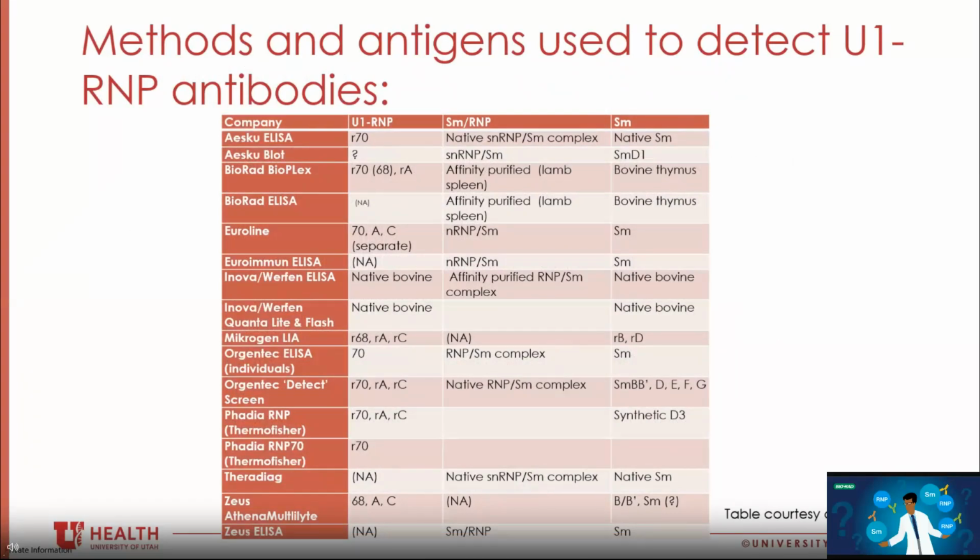Currently, the RNP autoantigen associated with mixed connective tissue disease is variably described as RNP or U1-RNP, based on the U1 RNA found to be the RNA component, and is detected using cellular extracts such as those used for the detection of Smith RNP antibodies, or purified proteins, recombinant proteins, synthetic peptides, or dominant epitopes of the three main RNP proteins, 68/70, A, and C, either singly or in various combinations, typically in the absence of RNA.